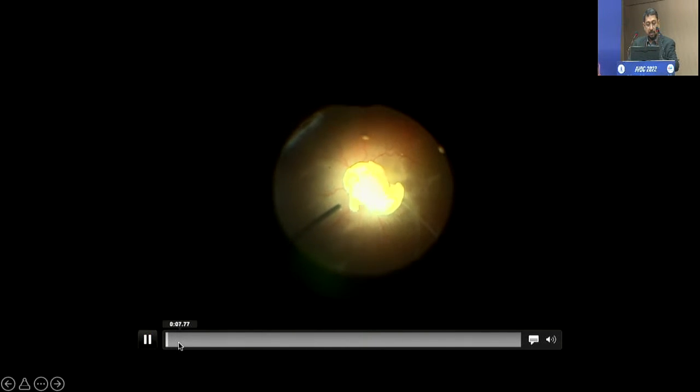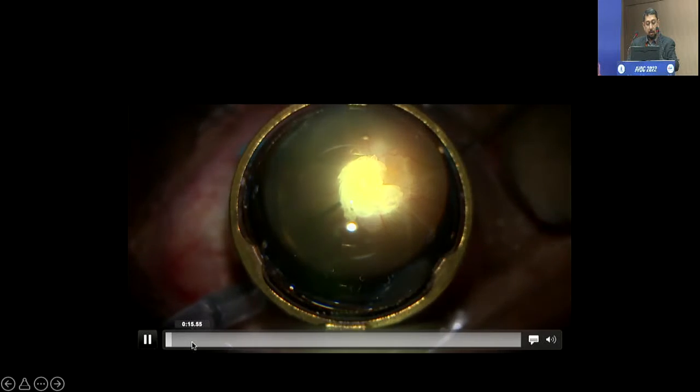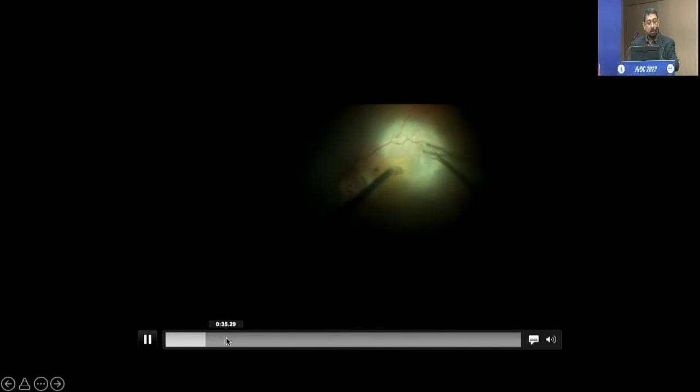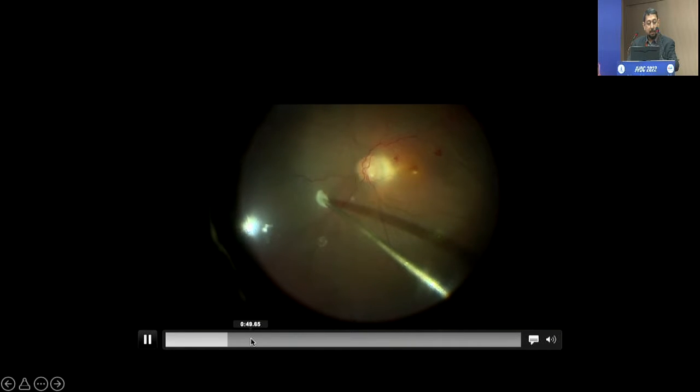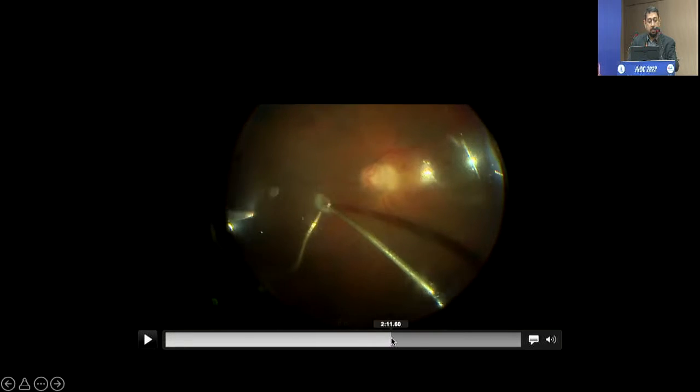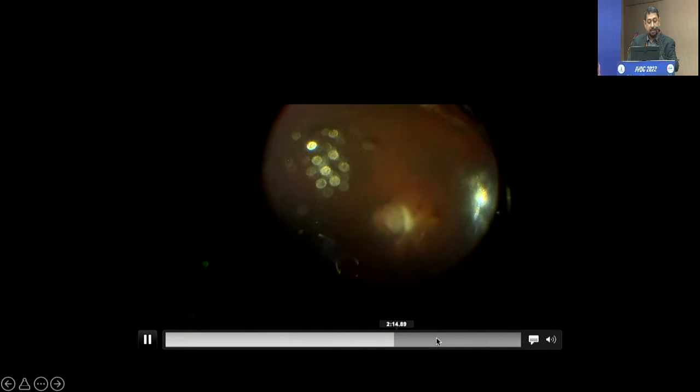So this is just quickly another surgery in which we've stained, and this is a macular hole detachment with a macular hole. We've done ILM peeling around the macular hole, and created a retinotomy by the side. You don't usually drain through the macular hole when you want to settle a retina, so you take a peripheral drainage retinotomy and you flatten the retina after that.